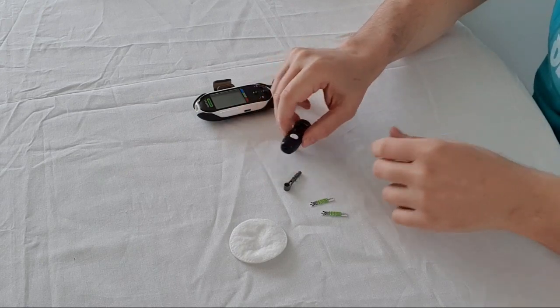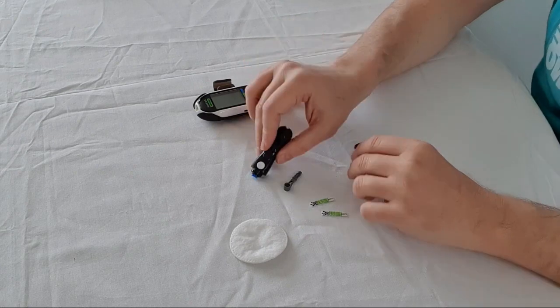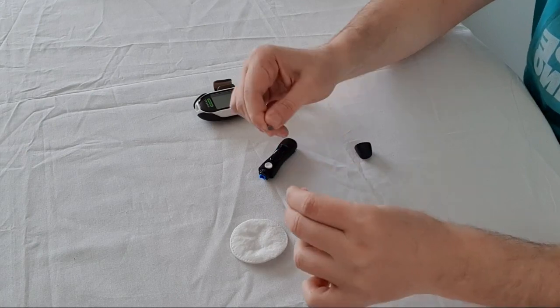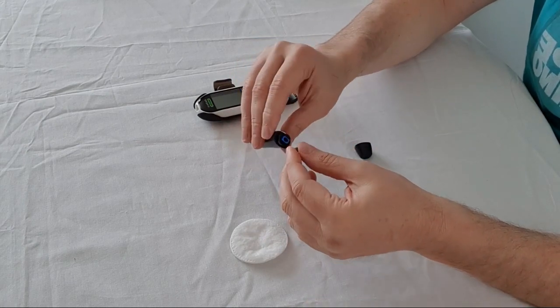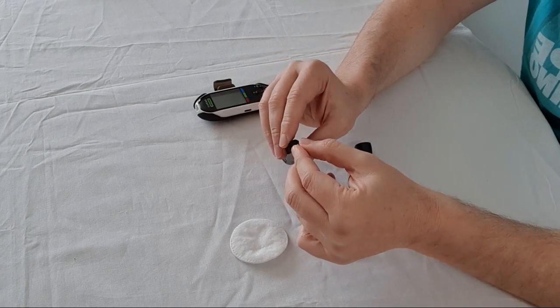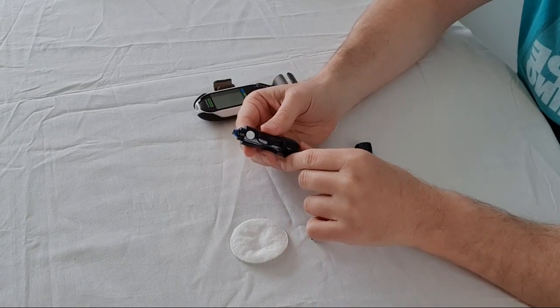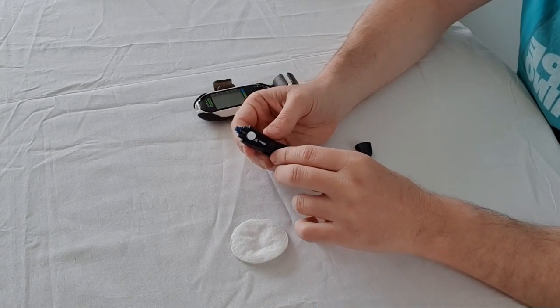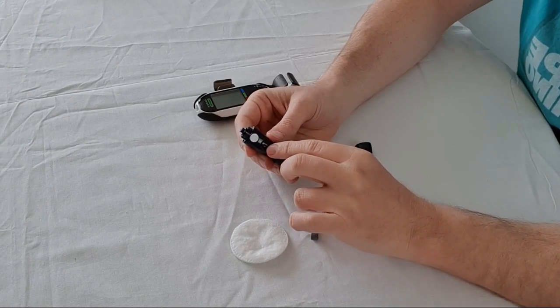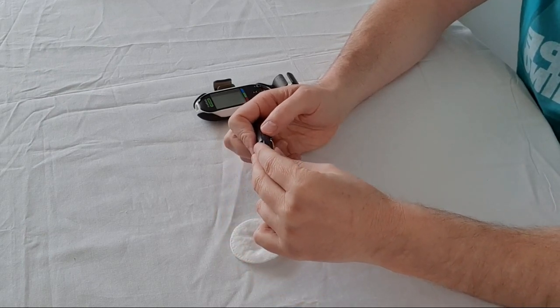The next thing we want to do is load up the lancet. Take the needle, twist that end off, and put it in. Alternatively, the safer way is to place it in there first and then twist it off, which is what I actually recommend. Then you load the device by pulling this back, which locks the needle into position, and then place the protective cover back on top.